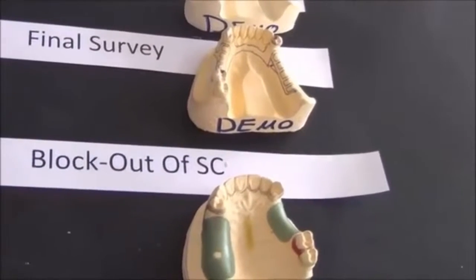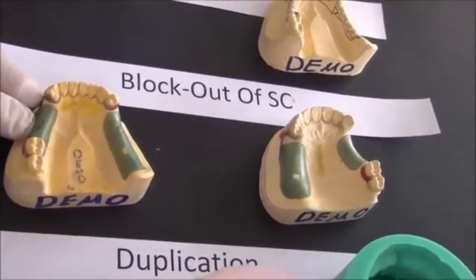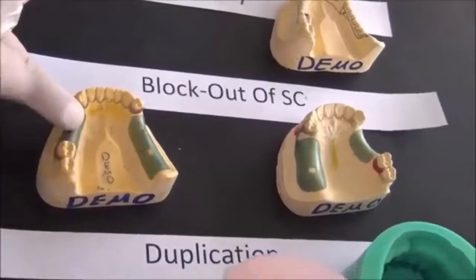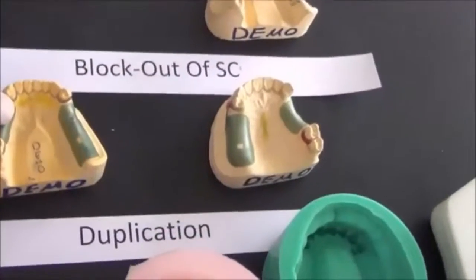So we need to do what we call a duplication. This is the secondary cast with the blockout material on it, and we need to place metal over it. So this material does not stand metal. Stone does not stand the temperature of the casting machine. So we need to use another material.